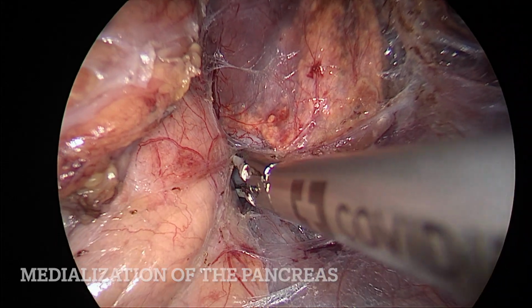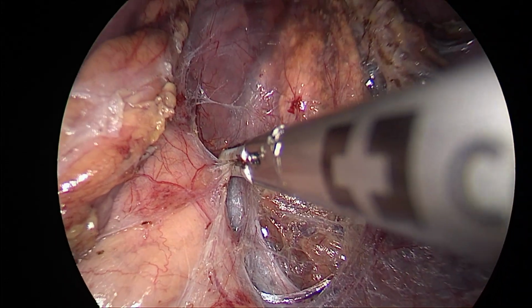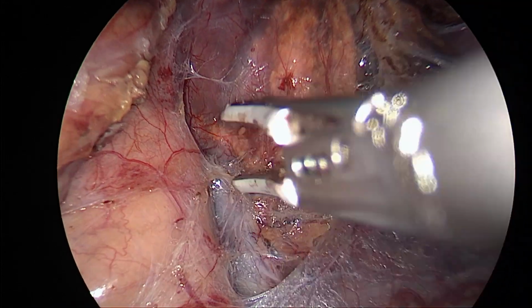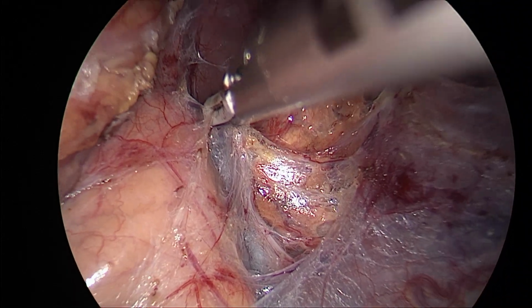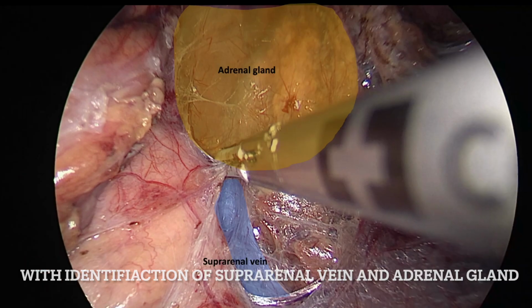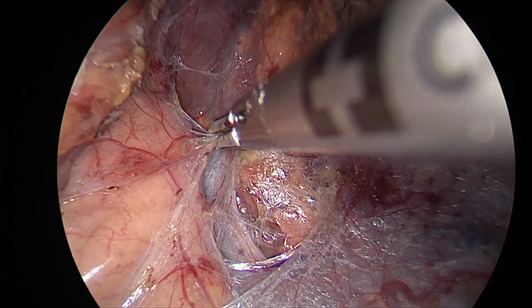To gain access to the suprarenal vein, the pancreatic tail was medialized. Especially for less experienced surgeons, the minimally invasive unique view of the close spatial relation of the pancreatic tail and spleen was of great learning effect with respect to splenectomy. Careful dissection towards the suprarenal vein allowed safe identification of the tumor.